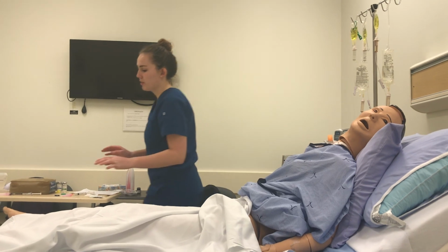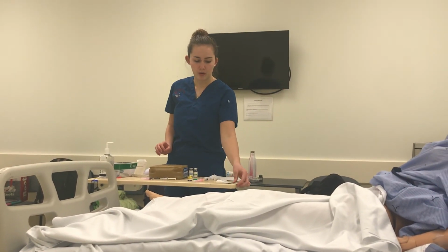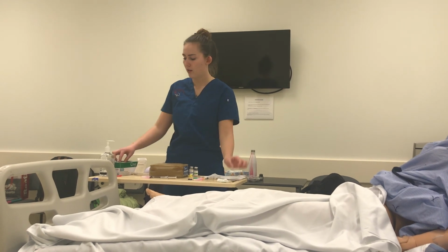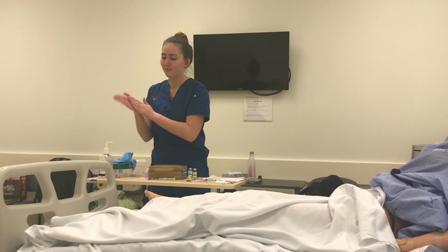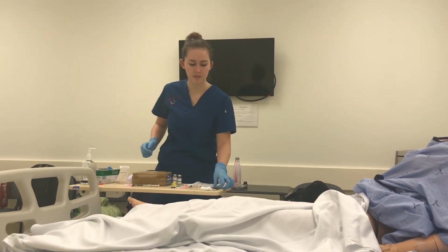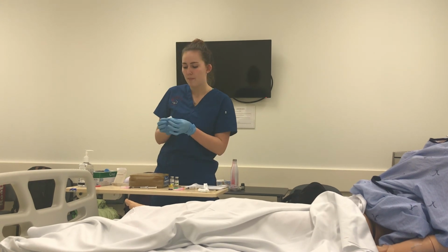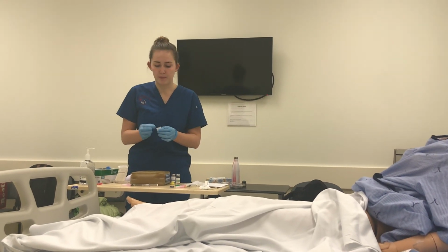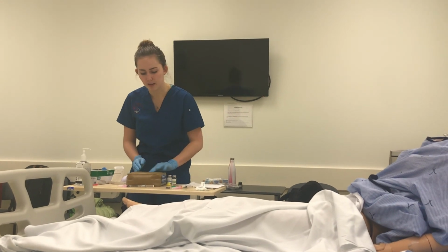And now we're going to switch to our subcutaneous injection pad. What we want to do is first put on gloves and perform hand hygiene, and clean the area with an alcohol swab, making sure to start from the site of the injection and circle outwards 5 centimeters in diameter.